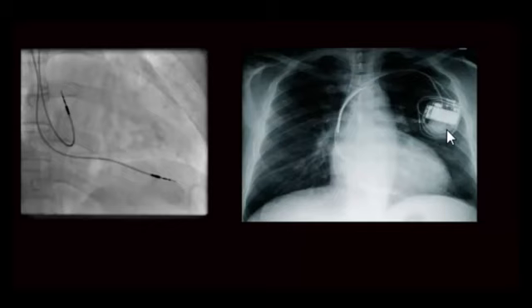When it gets close for the pacemaker to be replaced, generally the pacemaker company will check it and let us know how much lifespan is left as far as the battery is concerned, in terms of months. So it is advisable to replace the battery if the lifespan is less than 3 months.